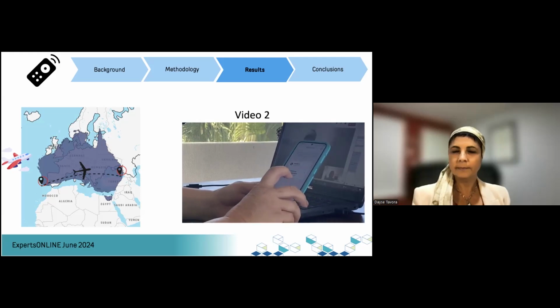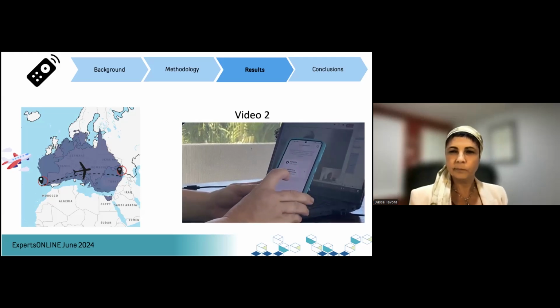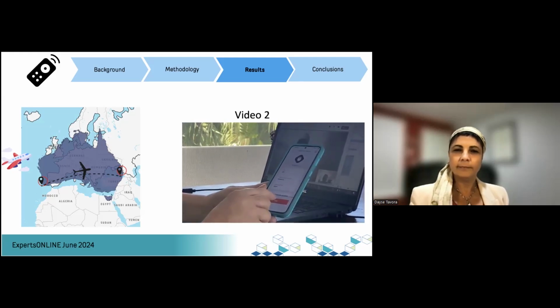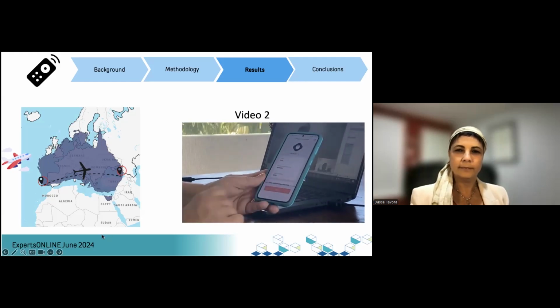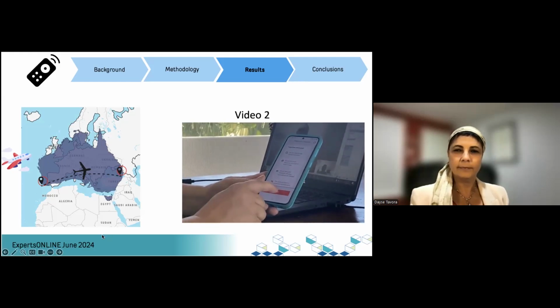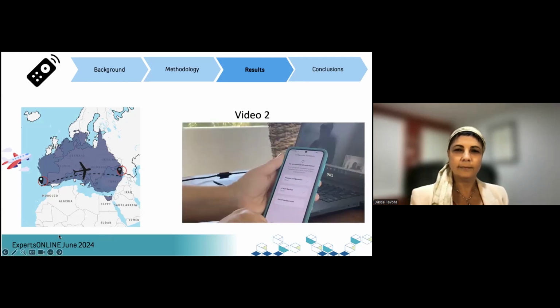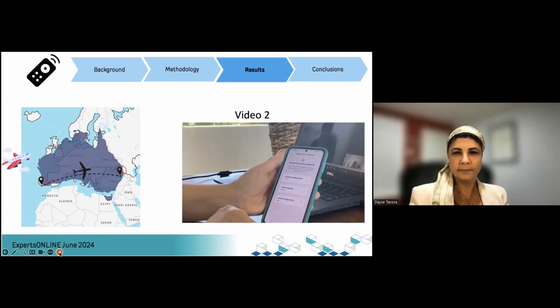And I have a new box saying install new configuration created today. So I've clicked on that and then next. And then install. Ooh. Okay, I've got green ticks on prepare configuration, create backup, and it's just installing the configuration.